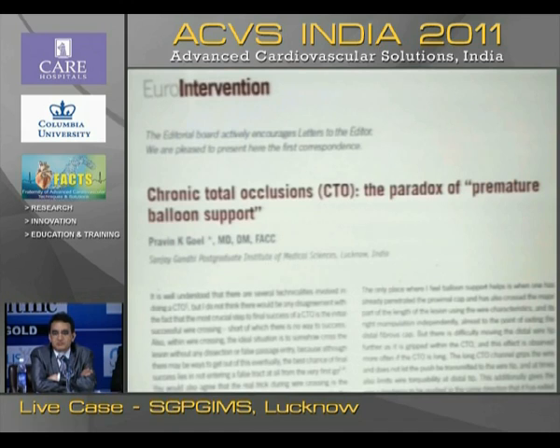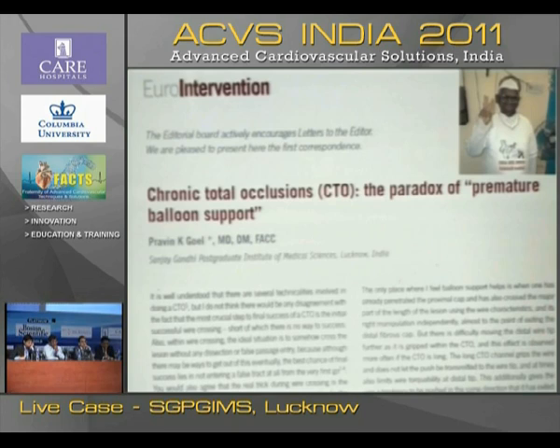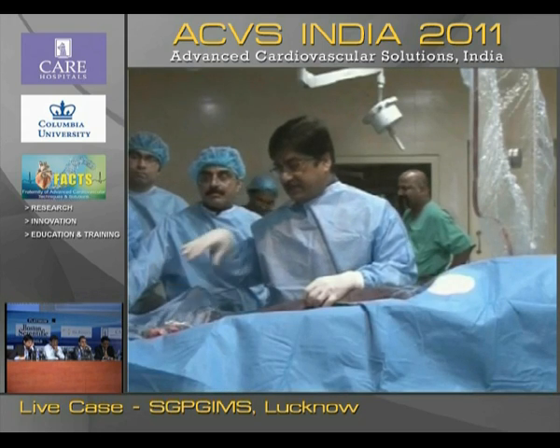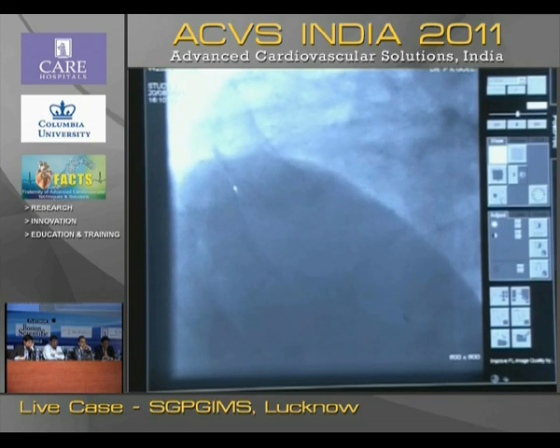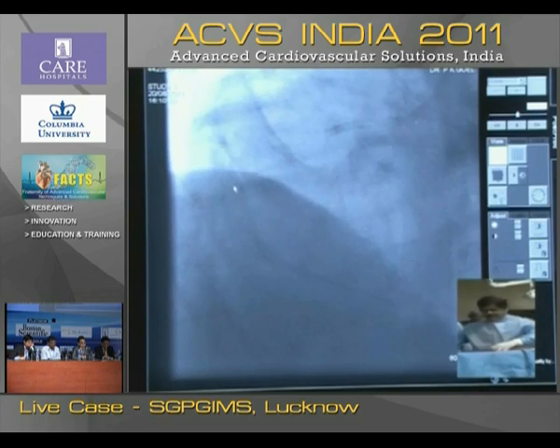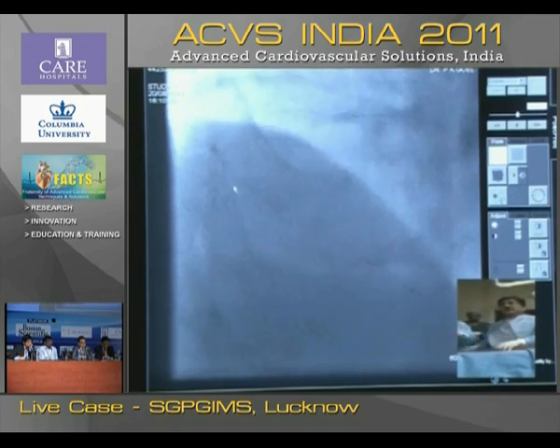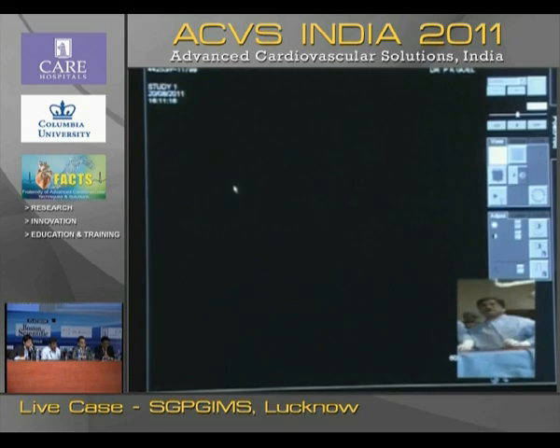You see, this is something which I wanted to show you. In fact, several times I don't use a support, but in this case I used it, because of this proximal problem. You see, I'm dilating it there. There was proximal disease, and to traverse to reach the CTO, sometimes a stiff wire can damage the vessel proximally. Otherwise, the feel that you get with a bare wire, especially with the stiffer bare wires like Conquest, is very good without the micro also. So many times I don't want to use a support. But this case had its own special issues, so we had to use the micro.